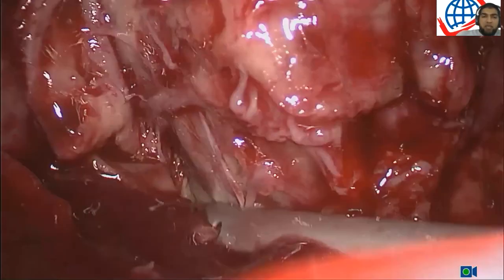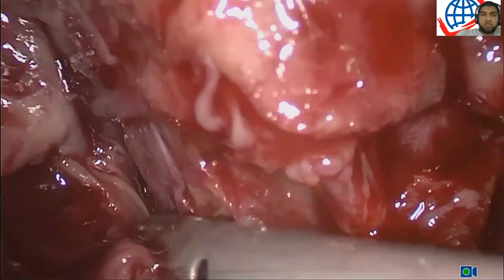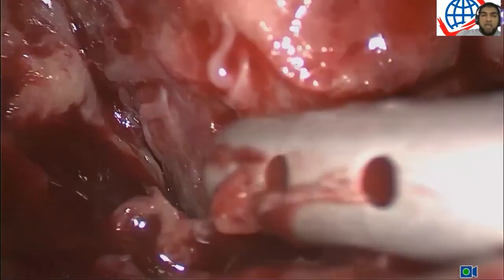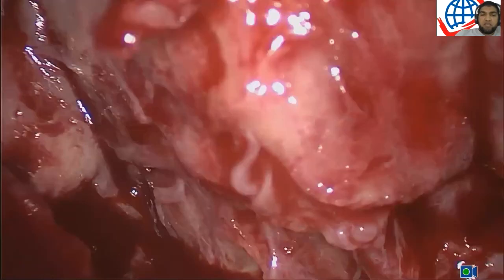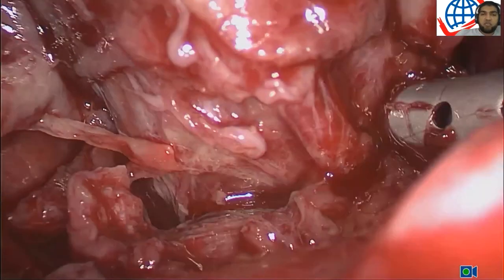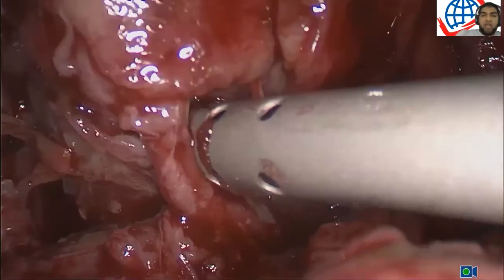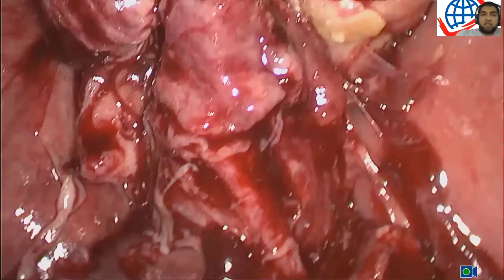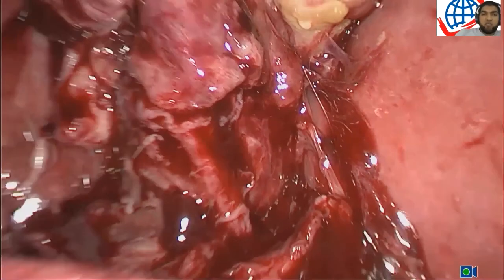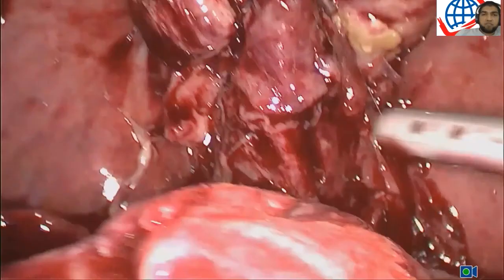I made the mention previously of how I use the suction. We use it for suction, we use it for irrigation, and we gently use it because it's a blunt tip instrument to gently tease away the tissues. Remember, even with this instrument, you can cause iatrogenic trauma. So don't push the tool wildly in an uncontrolled fashion. As I'm doing here, gently pushing at the tissues so that a lot of the exudative and inflammatory tissue moves away, and we can start to see some semblance of a gallbladder.